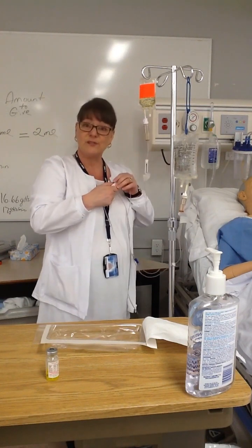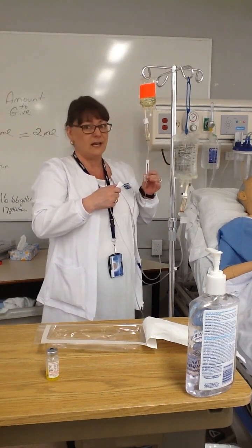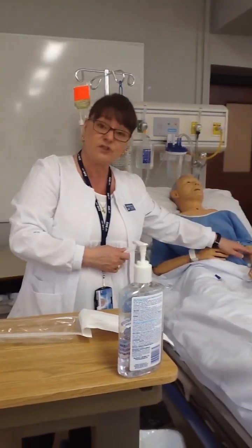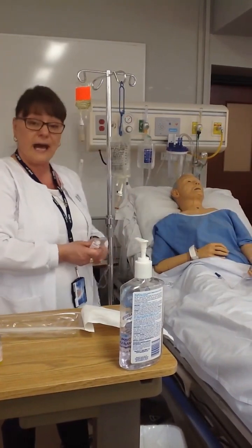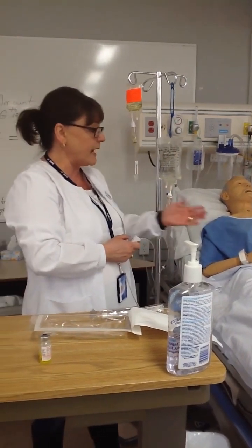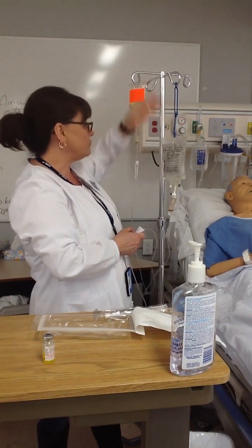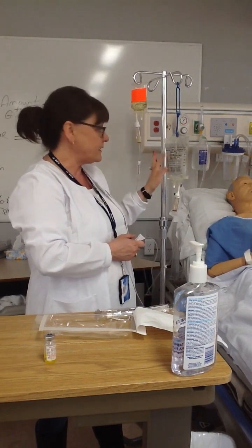And that concludes. Oh, sorry, that doesn't conclude. I would absolutely come in and check this IV intermittently in the time that it's infusing, and check on my patient and check my IV site to make sure that it's flowing properly, that it hasn't infiltrated, nothing's leaking, that my patient isn't feeling discomfort and pain or any adverse reactions. When it's completed, I would come back in and I would reformulate, switch out this little hanger, raise the primary set back up and re-regulate those drops for that solution.